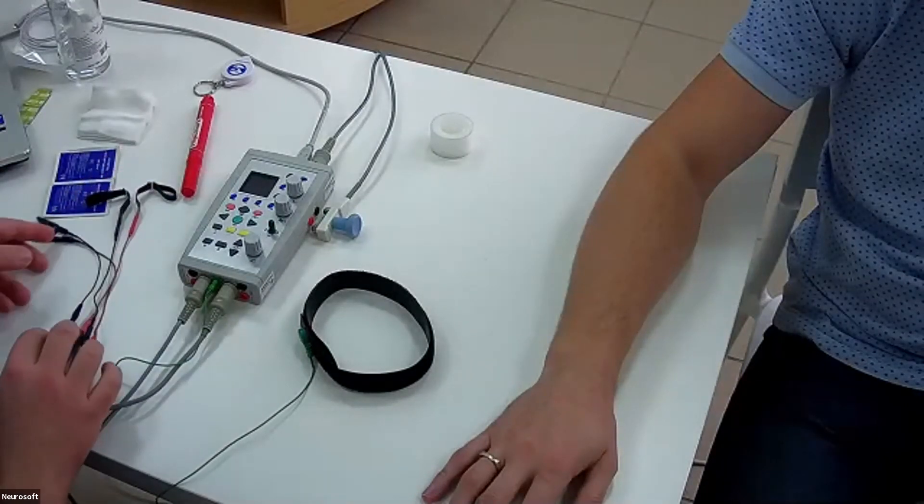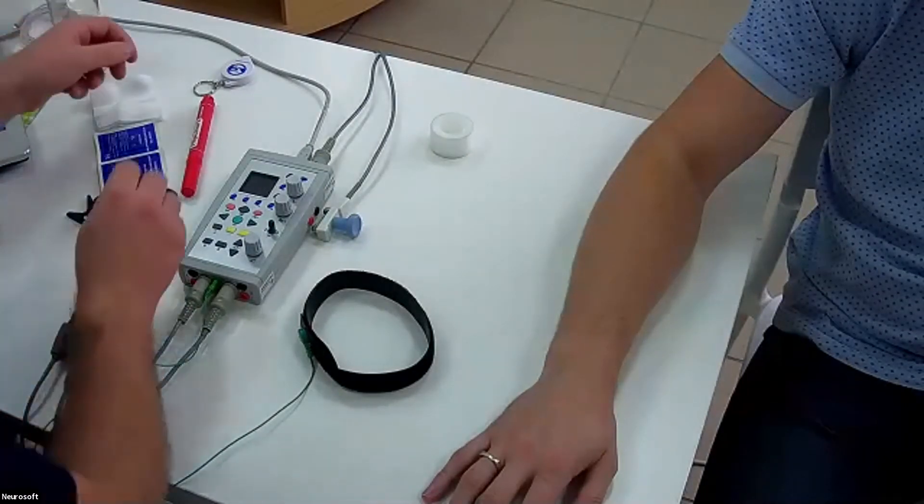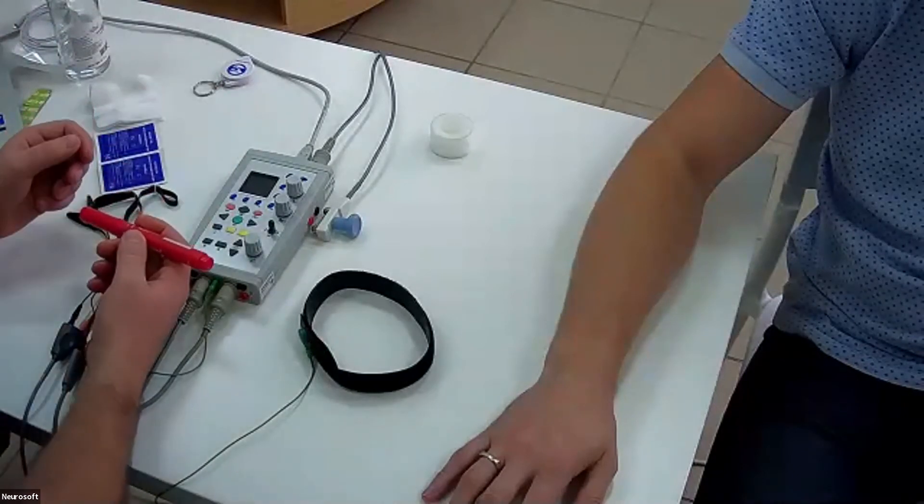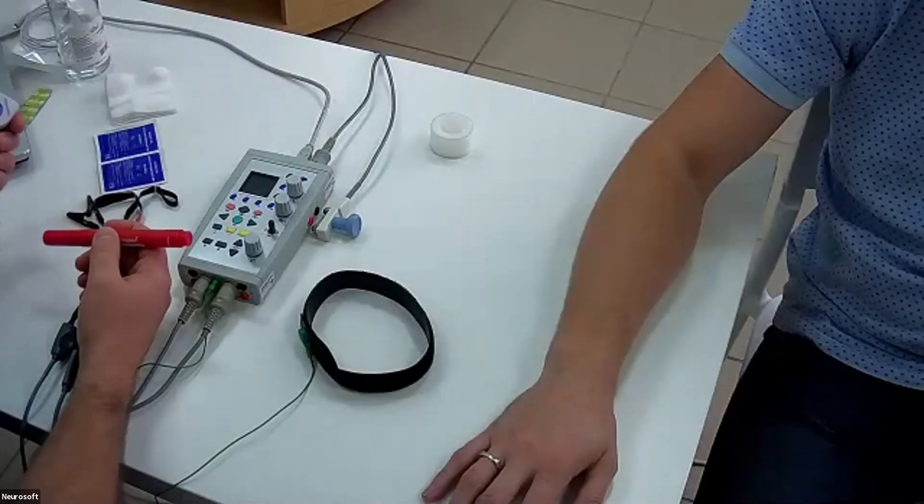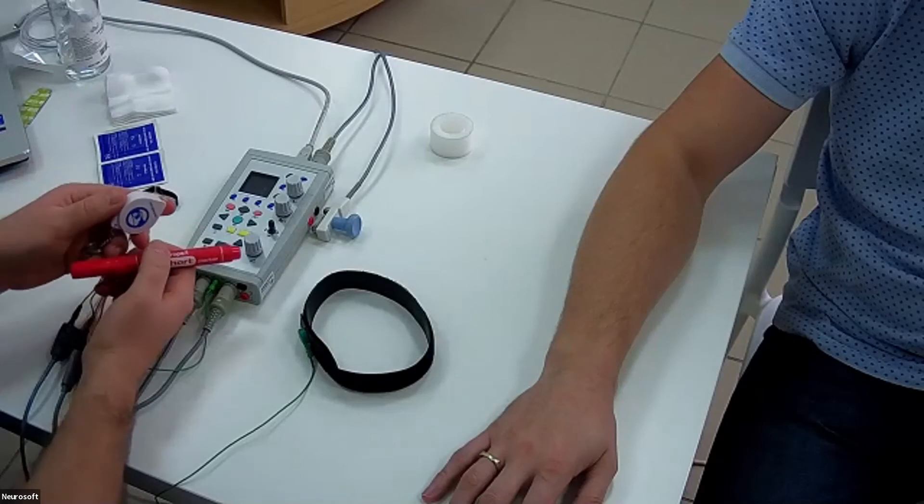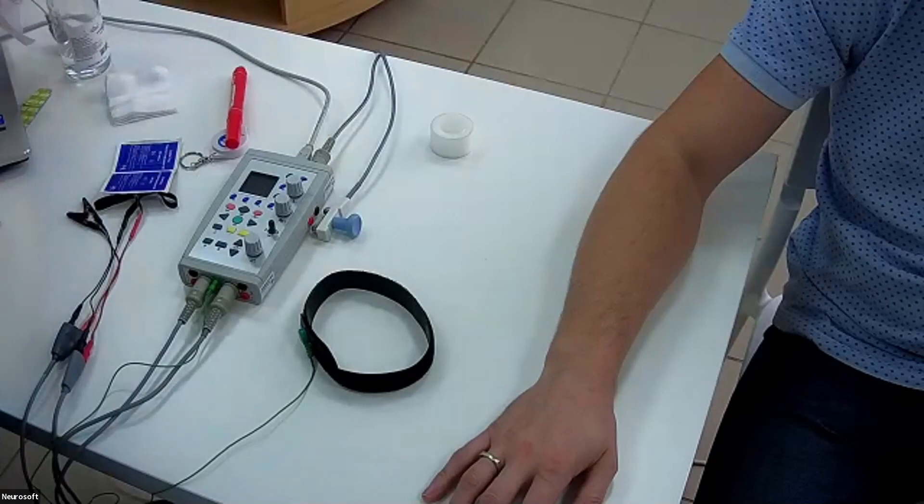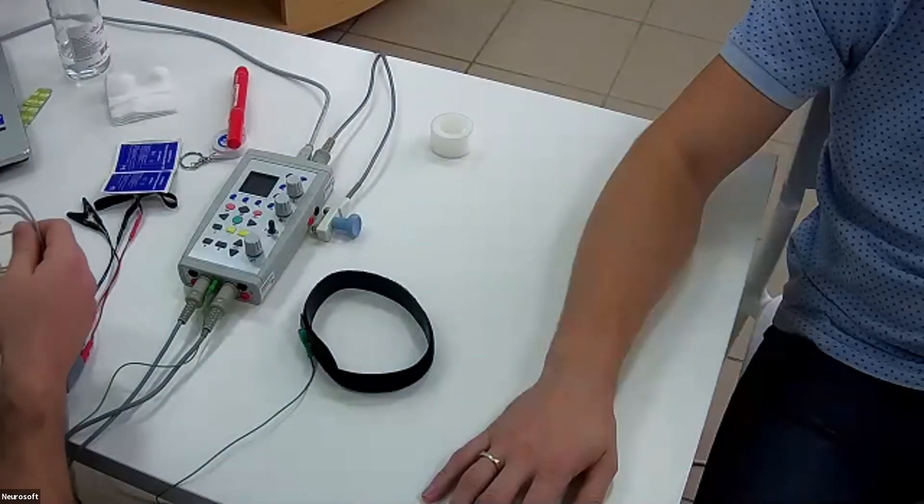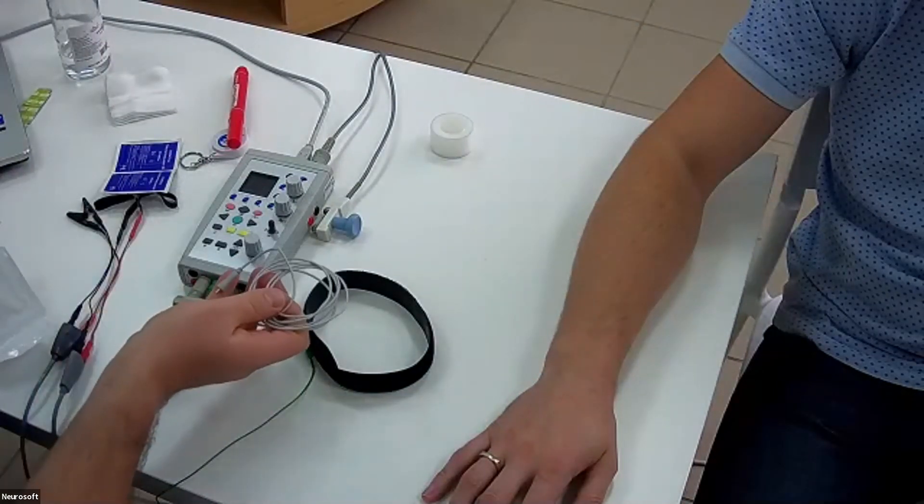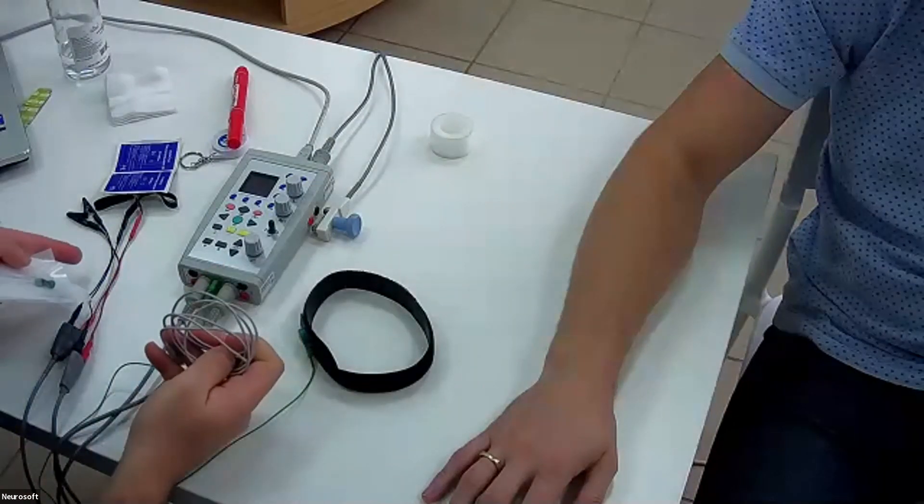Also, we will use a marker pen and measuring reel to measure distances. And for needle EMG, we will use an adapter for needles and needle electrodes.